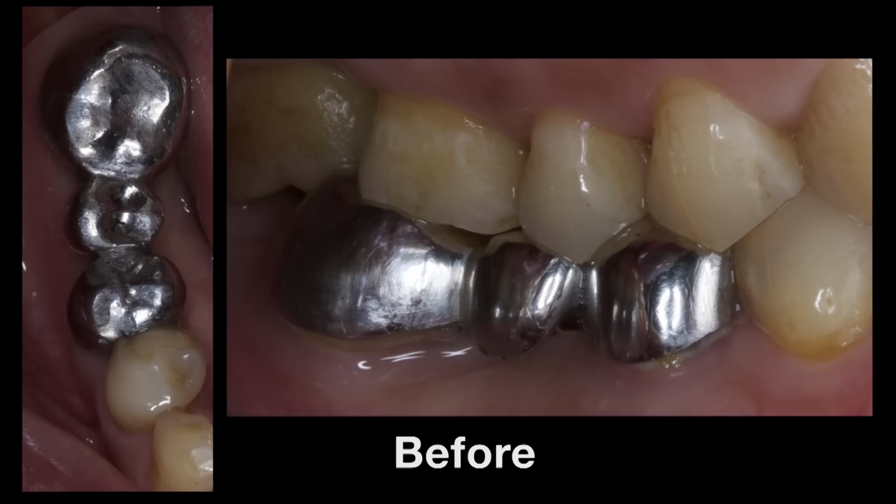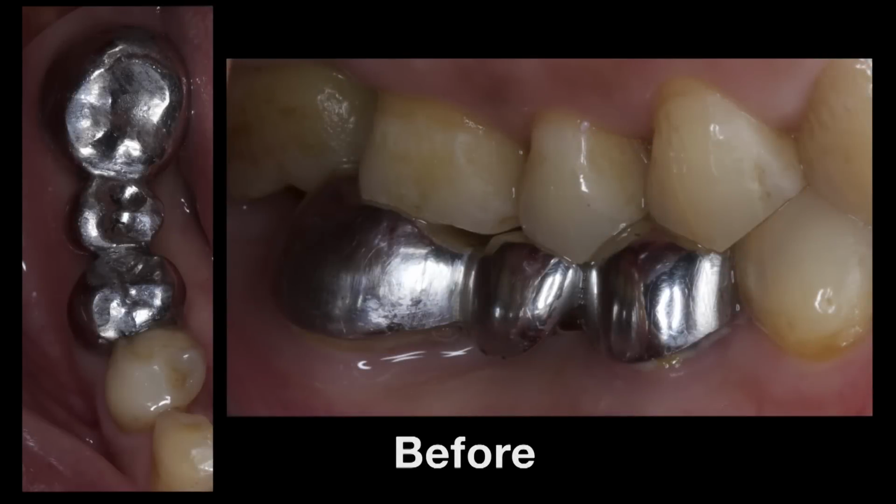Today I'm going to talk about how I get around a problem that I often face. When I am preparing the abutments for posterior mandibular bridges, I have always been conscious that my preparation may not be parallel enough to draw on a common path of placement. A good example is today's case. In this case, you will see how the previous dentist or technician had an unorthodox solution to this problem.